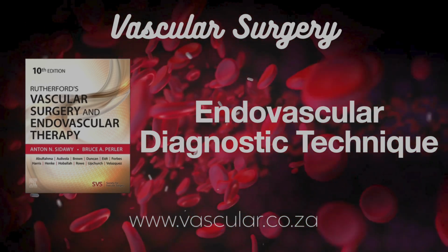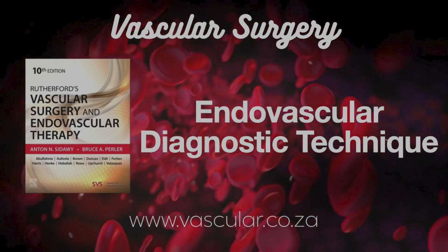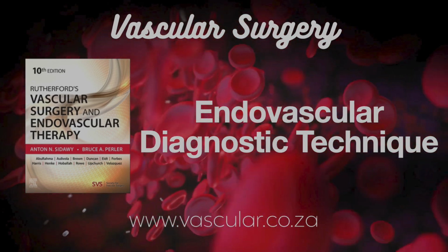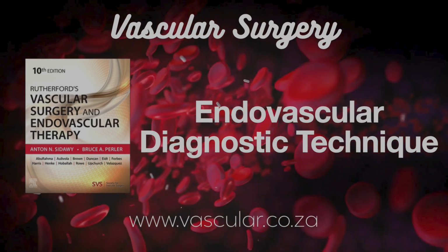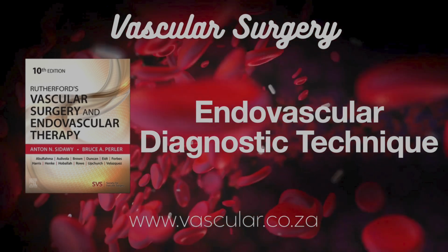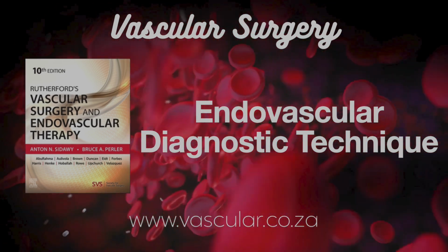Is access hard? Usually palpable during dialysis, but ultrasound helps for immature or failing ones. Often, just a small French microsheath is enough for diagnosis. Can upsize if needed for treatment like angioplasty. How do you image inflow versus outflow? Outflow veins are usually easy to see. Flow is brisk. For inflow arteries, you often need to temporarily compress the access site while injecting contrast to get it to flow backwards into the feeding artery.